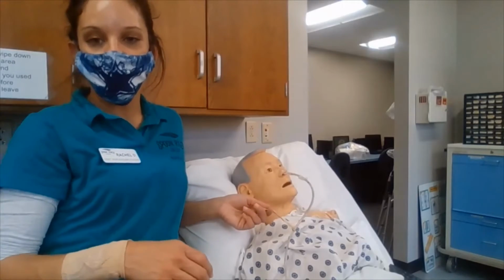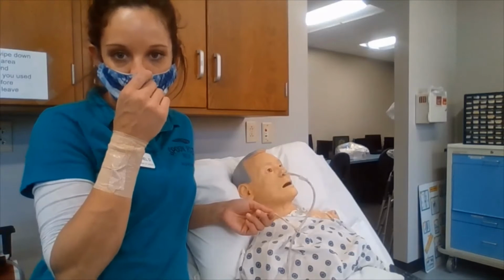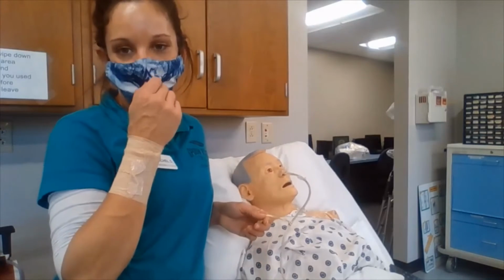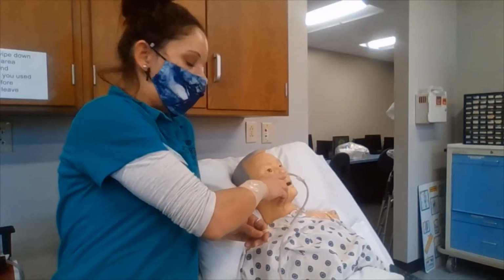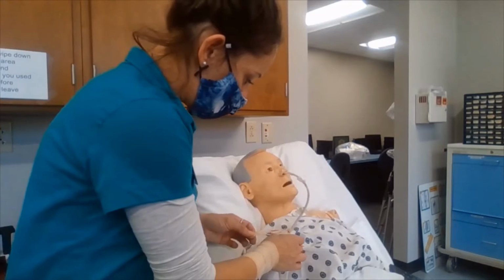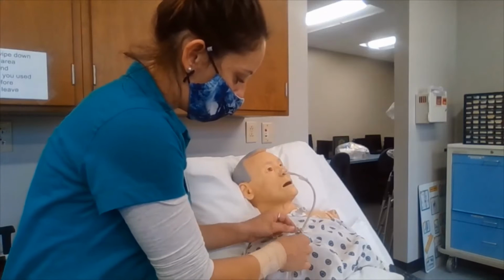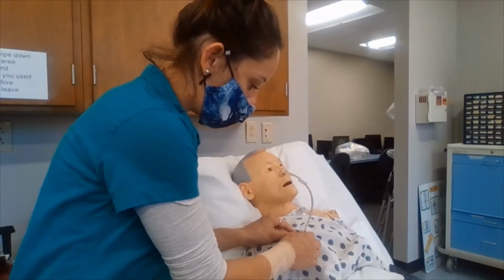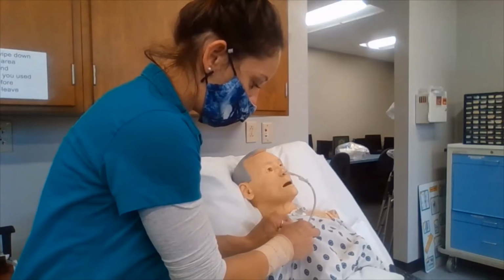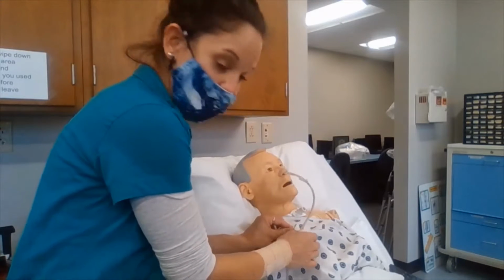We can also use a fixation device. So in that case, we would take the whiter part of it, and it would go over the bridge of the nose. Then we would position the connector where the tubing exits the nose. We are going to slip knot a rubber band to the tubing. We are going to secure a safety pin to the gown of the patient, and then put our rubber band securely in our safety pin.